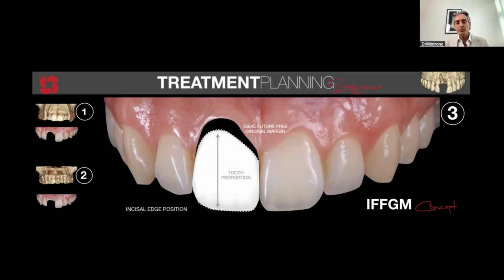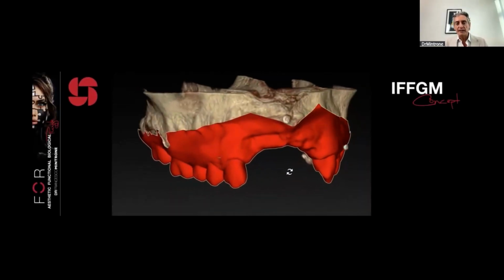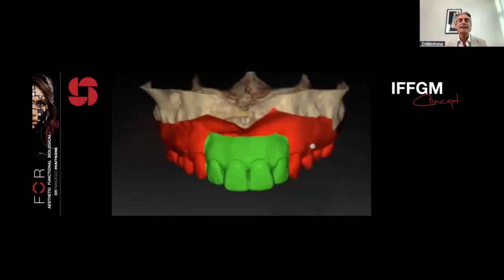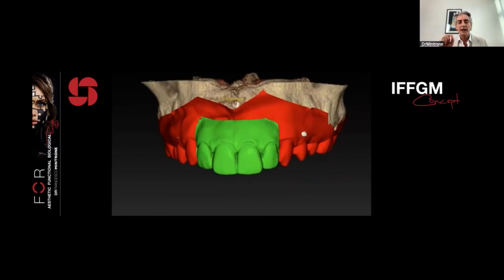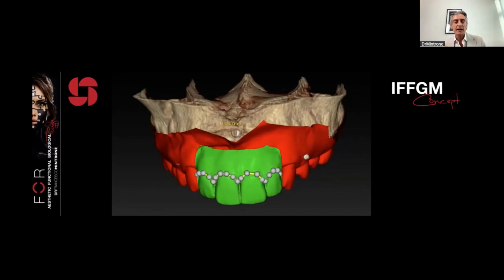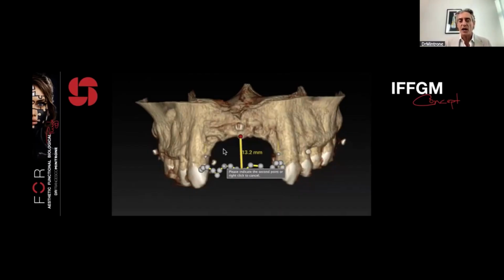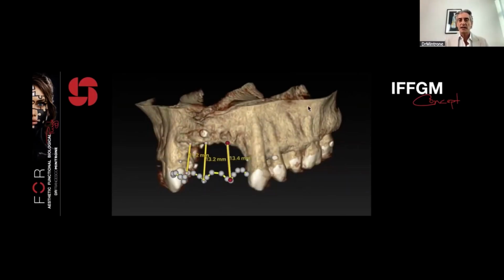Okay, so this is really important, especially in implant dentistry, especially in the aesthetic zone. Then, when we start to plan, like in this case, my rehabilitation, I'm never looking at the bone I have available, but I'm always looking at the ideal target. So what is the future gingival margin, the position of the incisal edges, and only in this way can I really plan how much bone I need, if I need to do a guided bone regeneration, if I need to do only a connective tissue graft, or how to create this kind of scallop design that is the base for the future proportion of our restoration. So for us, this is really important every single time we start a new case and a rehabilitation.